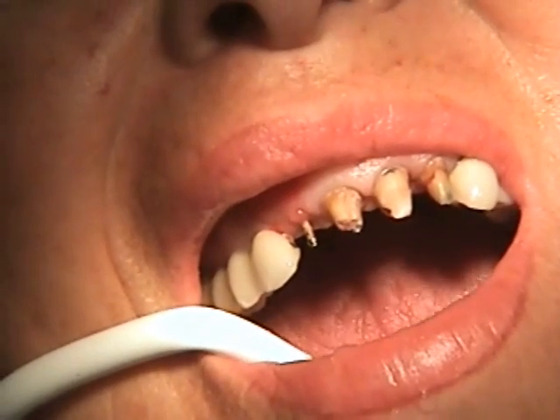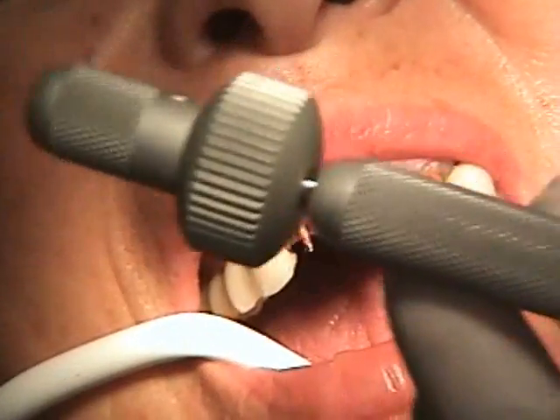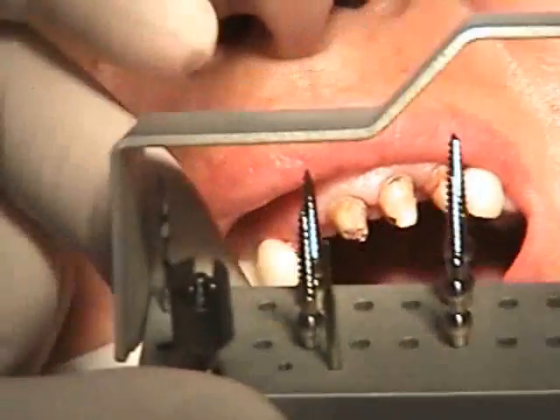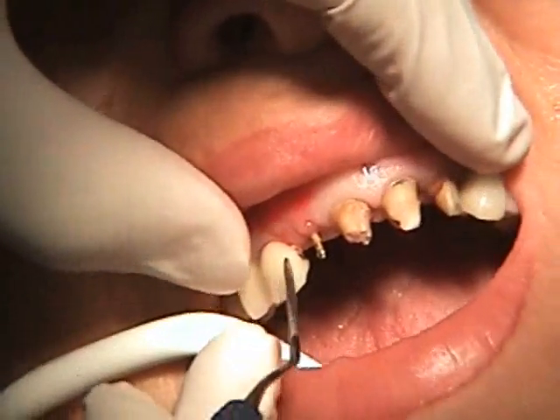It can't be removed with forceps under normal conditions. This is the tool we're going to be using to place a special pin in the root to remove it. Here are the special pins that are going to be utilized to help extract this root.